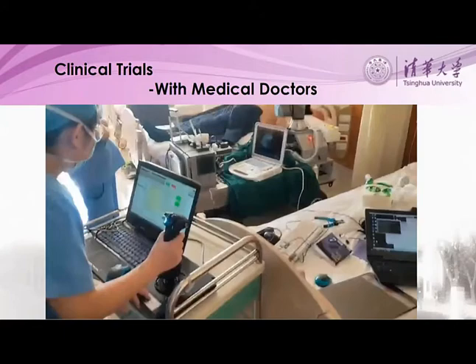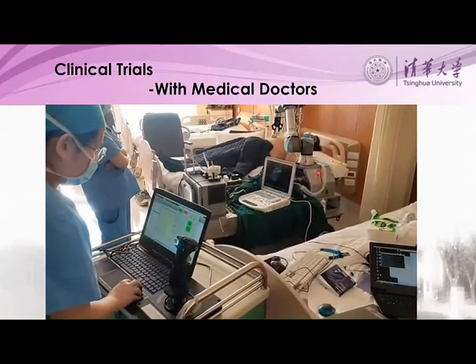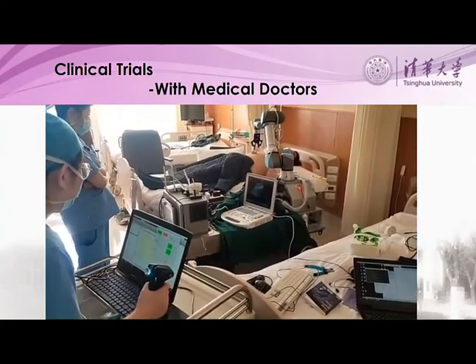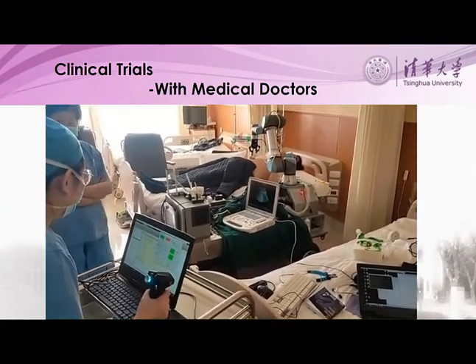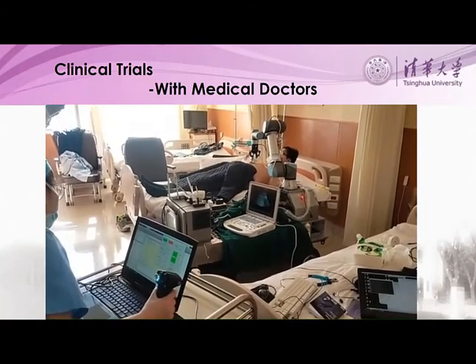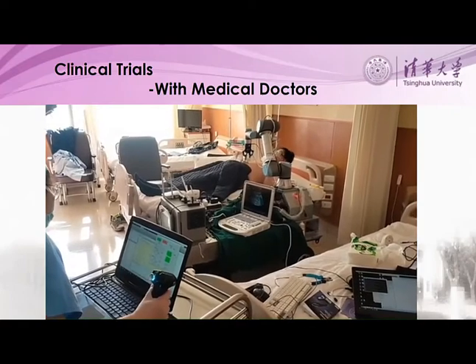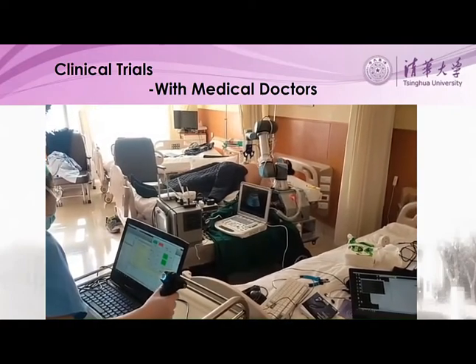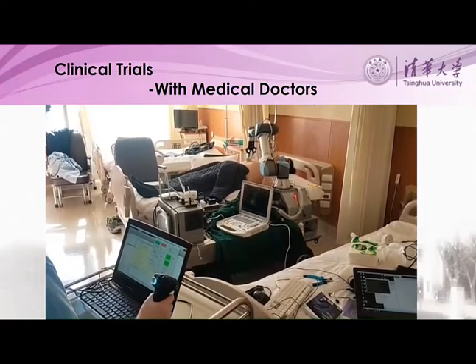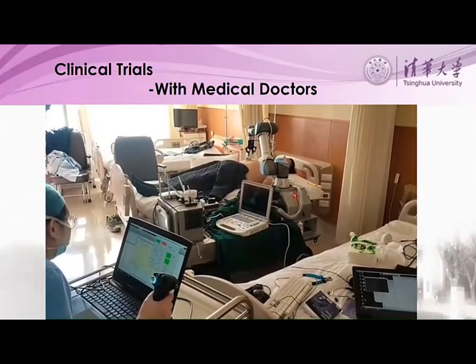This is a clinical trial with medical doctors. This is a scenario of ultrasonic examination performed by the robotic arm. Ultrasonic examination is considered an important method for monitoring the lung condition, since CT examination is harmful to health. Now the doctor uses the joystick, and you can see the doctor adding liquid coupling. You can see the robot moving very smoothly on the body surface.